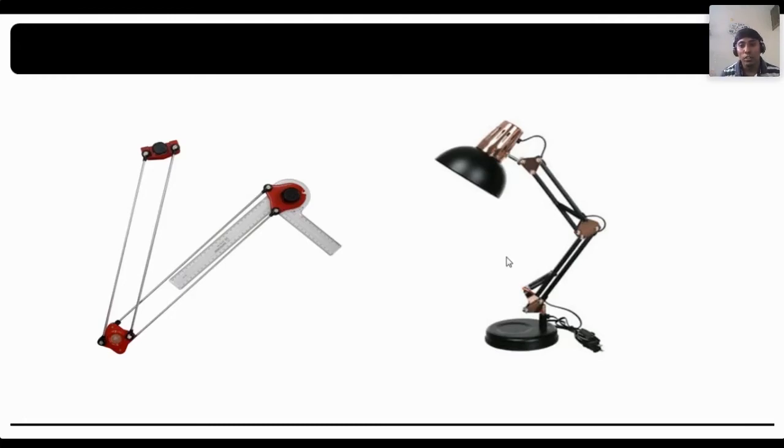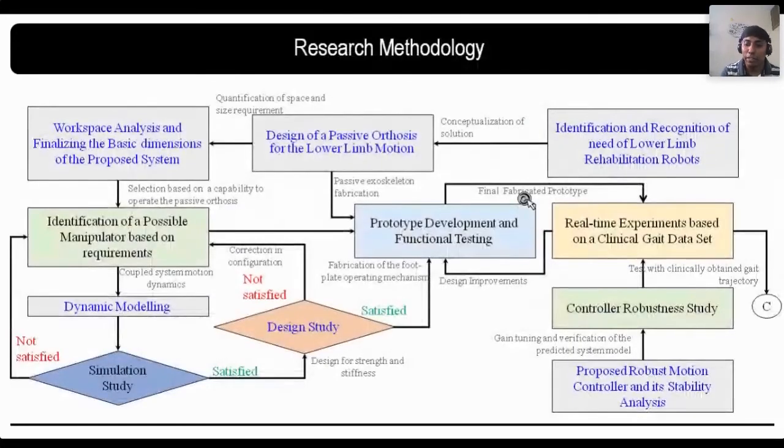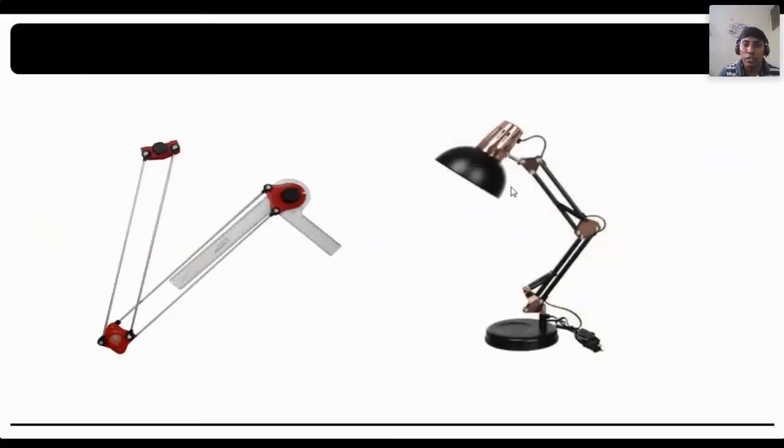So one, you can clearly focus. You would have seen that there are two springs, and in some cases a parallelogram mechanism would be there. In some cases it is just a spring. You can see that this spring is trying to overcome the gravity, which is induced from the weight of this part. So this is what we call the gravity balance.